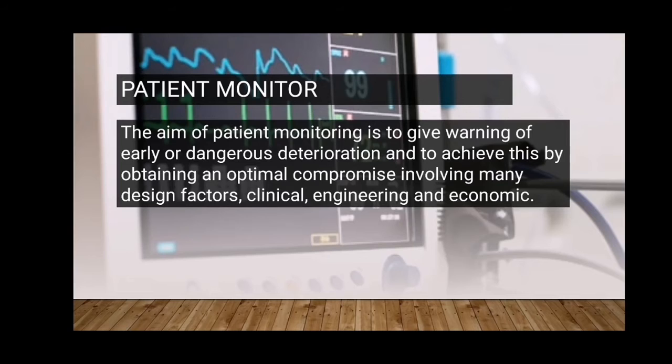Patient monitor. The aim of patient monitoring is to give warning of early or dangerous deterioration and to achieve this by obtaining an optimal compromise involving many design factors: clinical, engineering and economic.